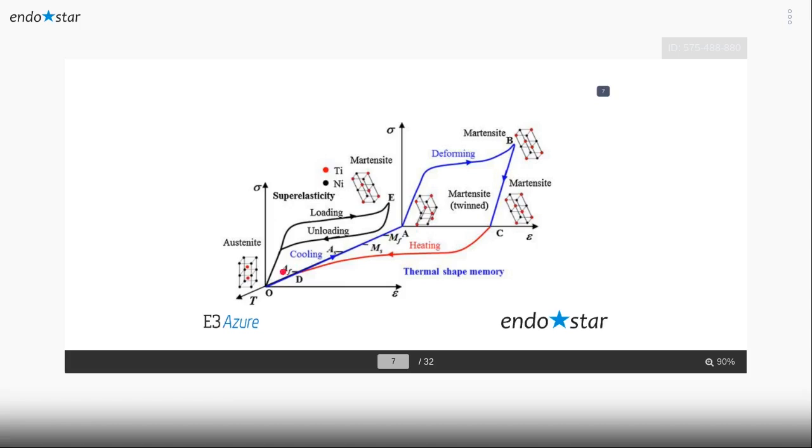So here you have the austenitic phase wire under heat process. It transfers, we have here AS and AF. This will return back again when we come back from here to back here. But we have here martensitic start and martensitic finish, which is all the matrix of the alloy, mainly martensitic phase.